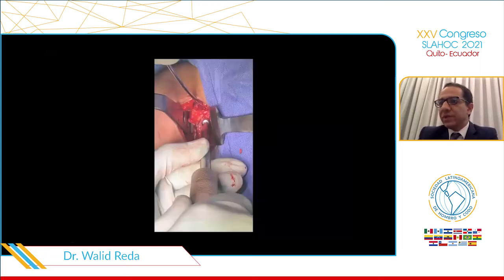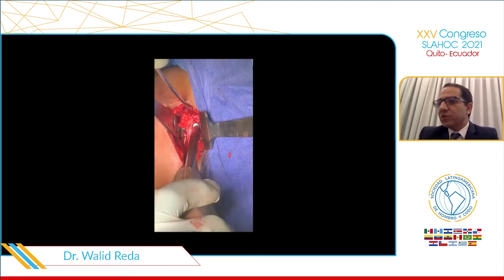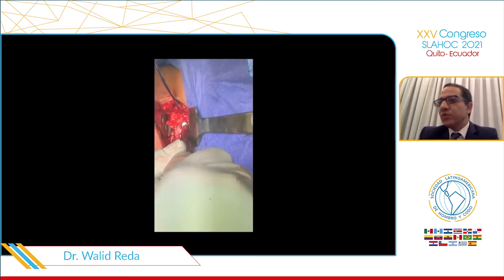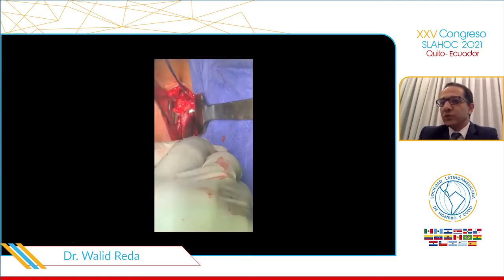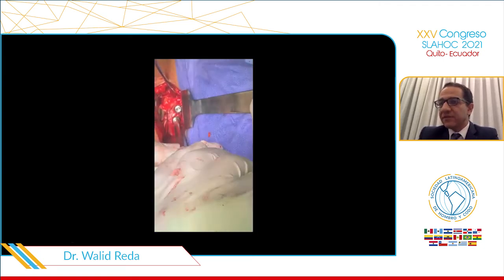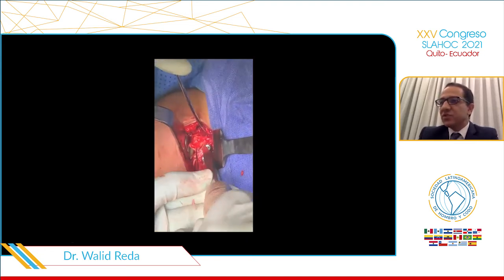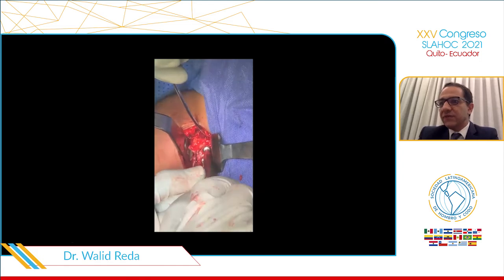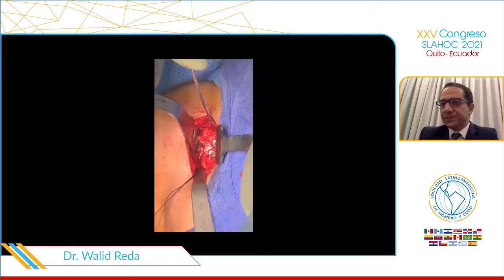Second, to avoid complication of graft fracture, as we learned from Dr. Gilles Walch, we must tighten the screws alternately using 2 fingers only, the 2 fingers technique, so as not to use too much force and break the graft. Number 3, the third point, we must confirm that the graft is not overhanging beyond the glenoid edge to avoid arthritis. If we do this, we will avoid the main complication of bone block procedure.